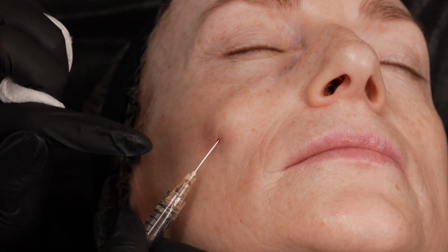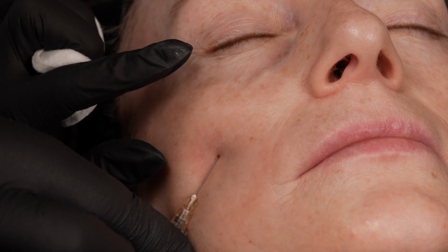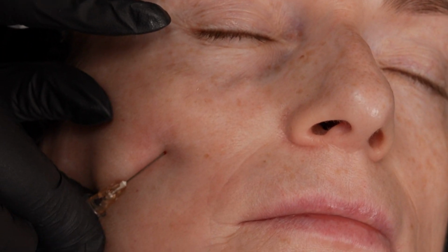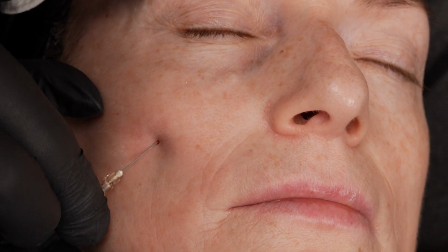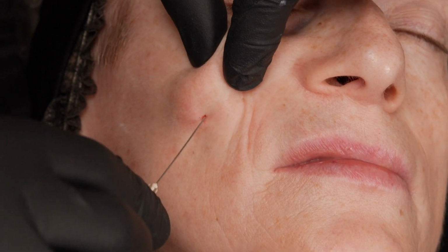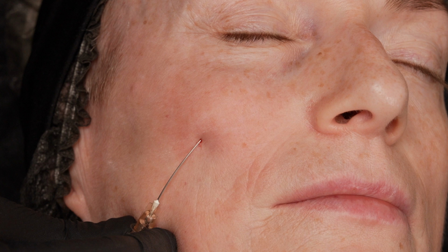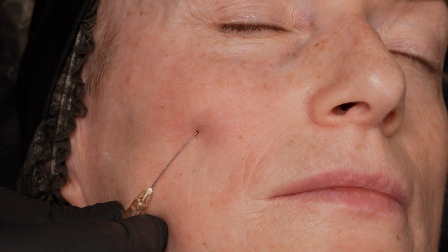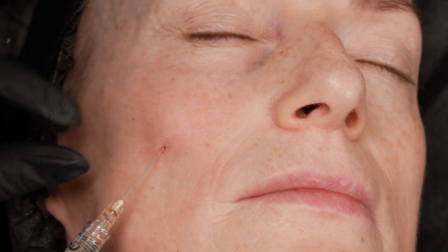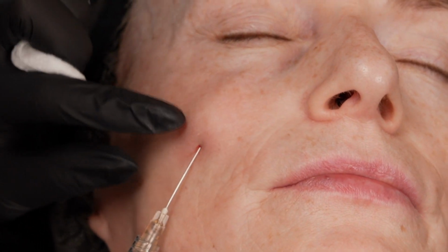Now, where is the tip of your cannula? It should be medial. Look, where are you? Okay. You're medial to the mid-pupillary line. This is the area where there is no fat tissue. This is the tear trough area. Give me. Here is the medial SOOF. You shouldn't see the tip of your cannula. If you go more medial, your cannula is in the tear trough area, where there is practically no fat tissue. The central part. Not medial to the mid-pupillary line. Now it is correct.